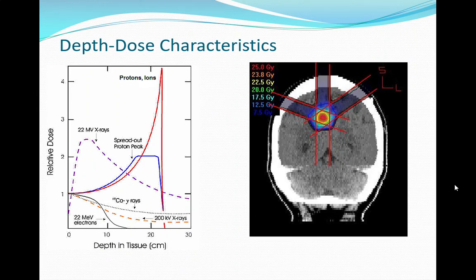I don't want to say you get too much higher, you have problems, because there's actually some special phenomena like flash that can actually be helpful in this, where you go to really, really high doses, but in very short time periods. But let's just say for a slower deposited dose like this, generally if you go higher, you're just going to cook the tissue more and more. You want to kill it, but you don't necessarily want a huge necrosis building up, right? So you want to build it over a more reasonable time period usually.